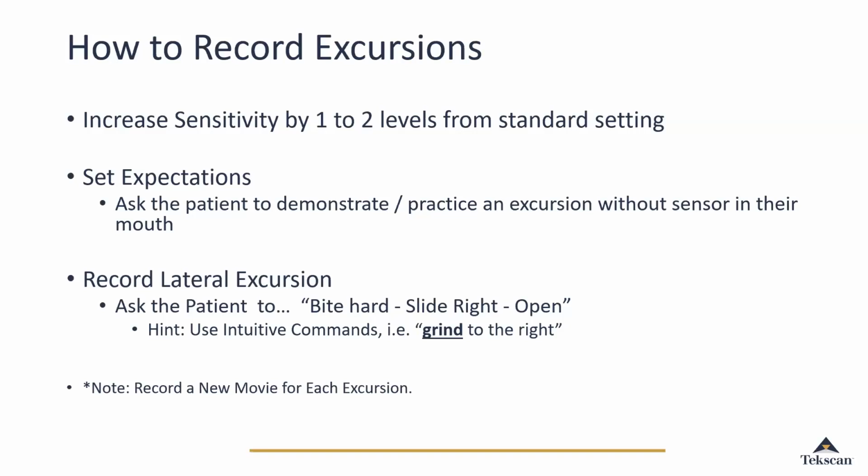You can use intuitive commands, like you might say grind to the right, because the patient may not understand slide to the right or move to the right or to the left. So grind to the right. Some people say rub your teeth to the right. But again, you just want to rehearse so that the patient is doing the right thing before you begin to take the scan.